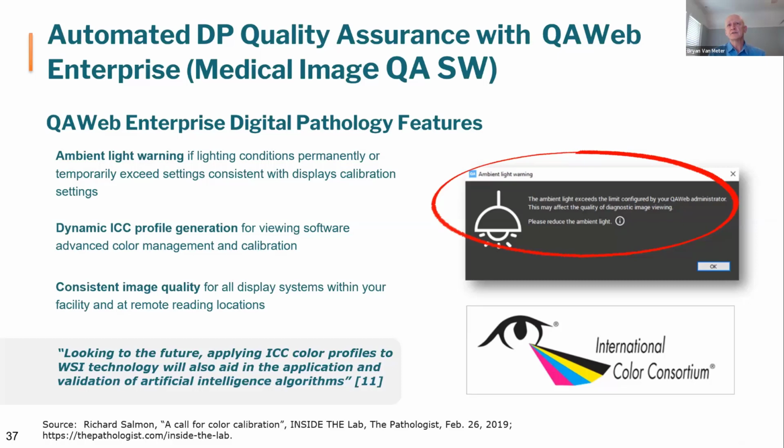But the idea that there is too much glare and too much light on the screen is something that definitely needs to be paid attention to. It's what a medical device does, or at least ours does.